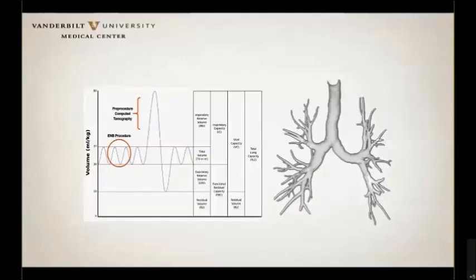And again, the same slide that we've already seen, just pointing out the difference between a pre-procedural CT scan obtained at total lung capacity with the patient fully awake and asked to take the deepest possible breath for a couple of seconds versus where the lung volumes are really going to cycle around during the procedure, which is completely different. It's obvious that you're going to get in trouble here.